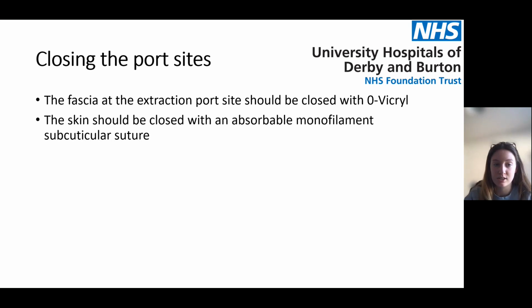So closing the port sites, you're nearly done now. So the fascia at the extraction port site should be closed with 0 vicryl, and then the skin closed with absorbable monofilament subcuticular suture.